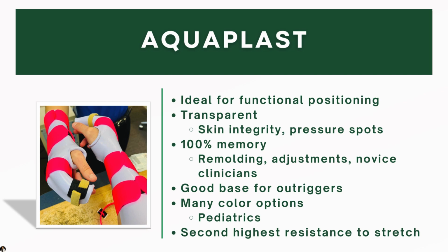It's a good base if you're using outriggers. So if you're making a dynamic orthosis, it has good stability, good bonding, it can adhere together. And there's multiple color options, which is nice for kids or somebody who may not be compliant with wearing the splint. Somebody who's paying out of pocket hundreds of dollars, they care what the color of the splint is. And it also has the second highest resistance to stretch, so it has very good drapeability.